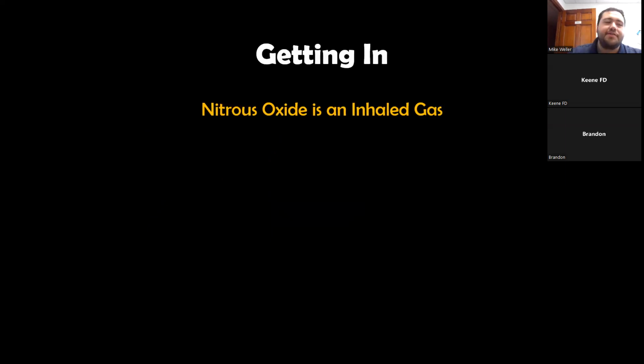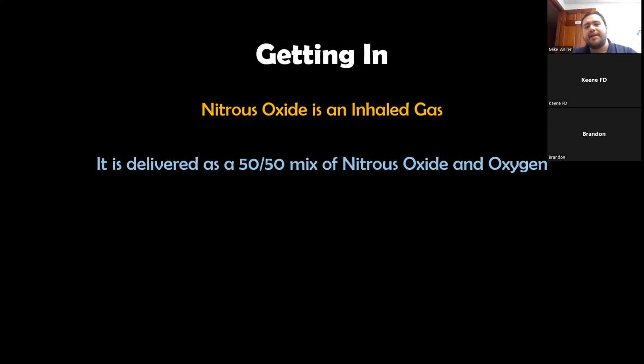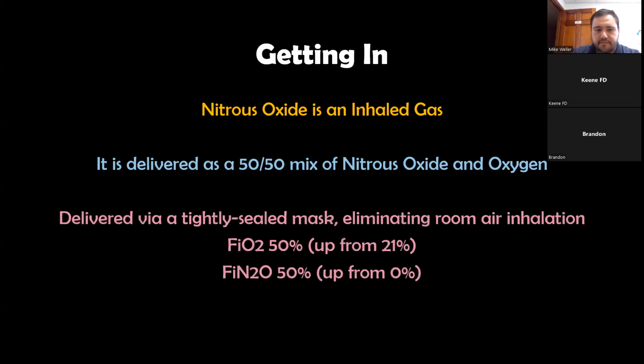We inhale nitrous oxide. So this is not going to be an IV medication. This isn't an IM medication. This is going to be an inhaled medication administered as a gas. It's going to be a 50-50 mix of nitrous oxide and oxygen. There is no way for you in EMS to change the concentration of nitrous oxide that your patient is going to be delivering. It's going to be a set 50-50 mix with this system. It's factory set. There's no way to change it.